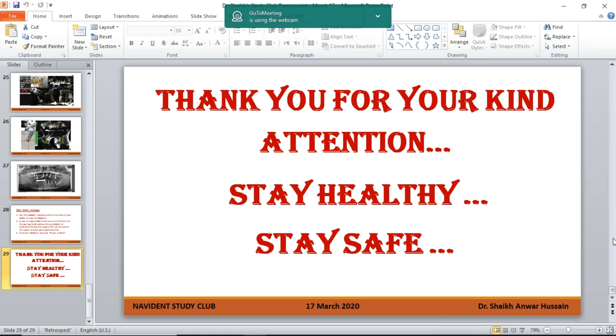Secondly, because I had the expendable teeth, I used the jaw tracker, which can be used by everybody for tracing for the upper jaw also. So I have used that before, and in this case I used it on the teeth which were to be extracted. So I thought I would get better results with this rather than depending on the head tracker. And secondly, with respect, Luca, the new head tracker, which is much more stable, was not with me at that time. I was working with the old head tracker, and that's the reason why I used the jaw tracker. Perfectly clear. Thank you.